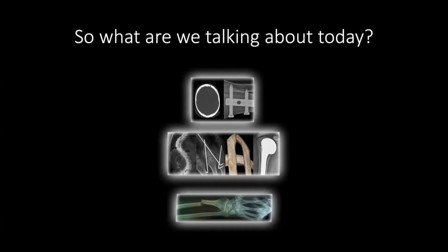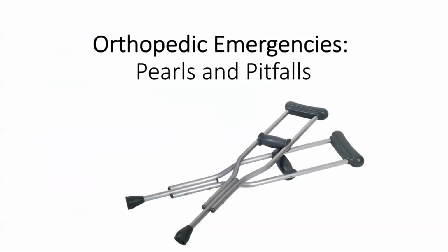So what are we talking about today? We only have half an hour. And so I figured rather than going through an exhaustive how to read a chest x-ray or something like that, we would just really focus on some high yield orthopedic cases that you will likely see out in the community. Many of these are subtle, but have pretty bad outcomes if we don't treat them right. And also many of these will show up on your in-service, so it's probably a good time to review some of these injuries.